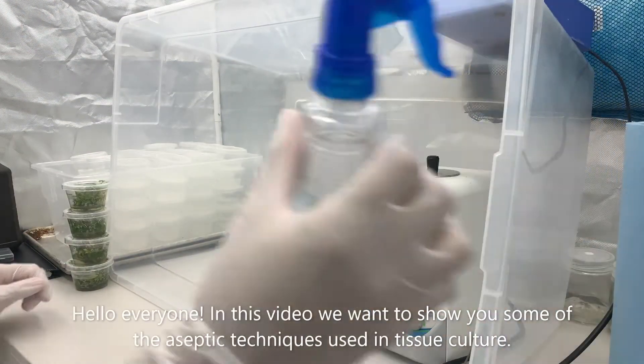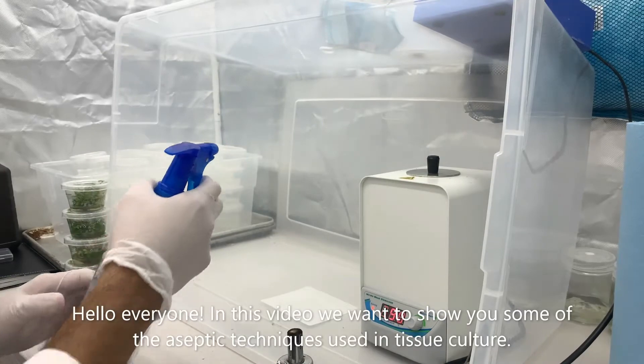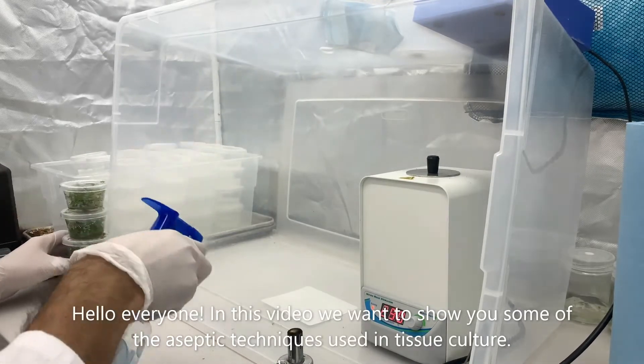Hey guys, in this video we wanted to show you some aseptic techniques you can use in tissue culture.